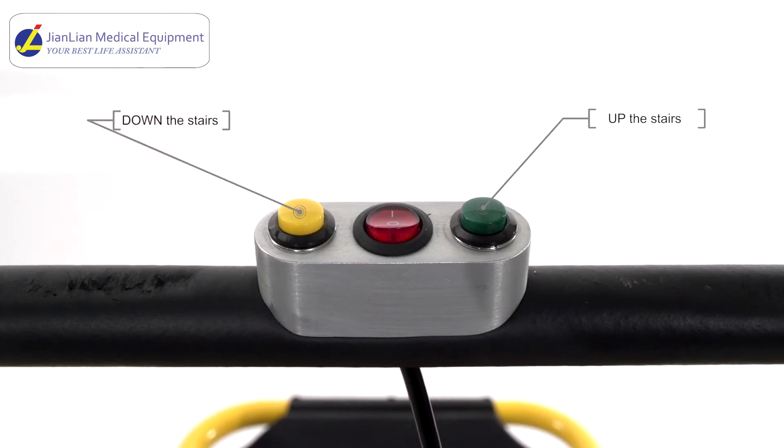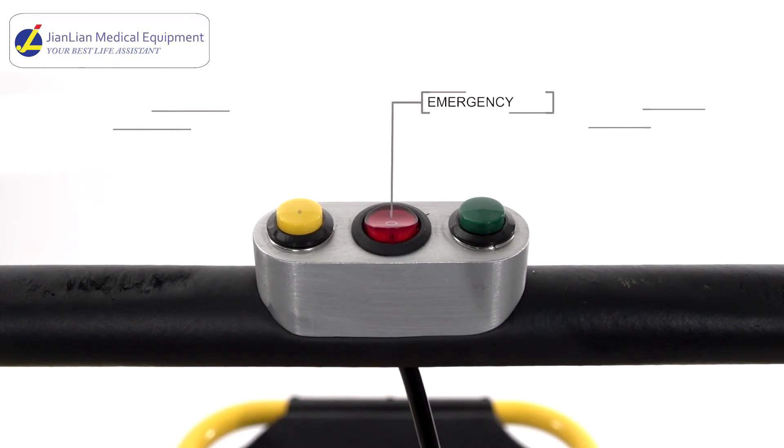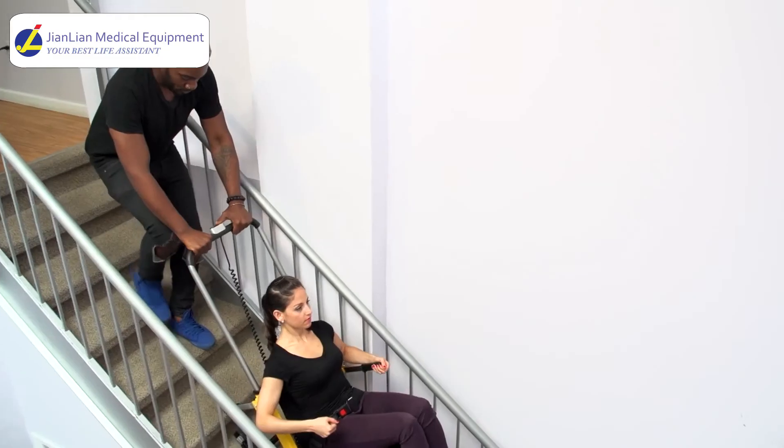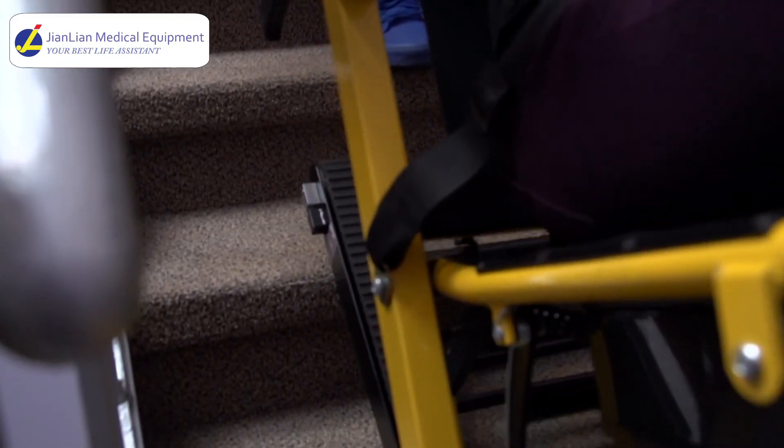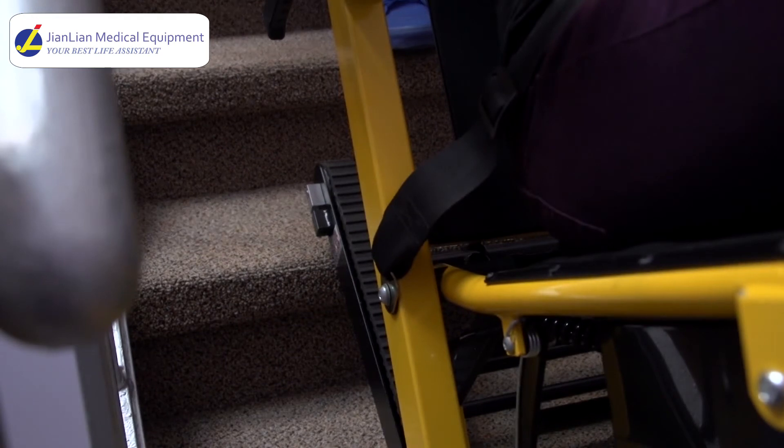The green and yellow buttons on top of the handlebar activate the tracks. The green button is to go up the stairs and the yellow button is to go down. When no buttons are in use, the chair will be in default brake mode. You can also use the red switch as an emergency power off brake. We highly recommend that you use another person at the front of the chair as a safety backup. As you move up or down, push the chair against the stairs to keep the rubber tracks flush against the stairs. Do not hold the weight of the chair in your hands.